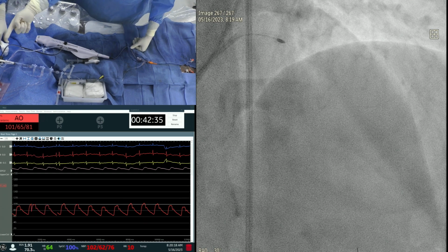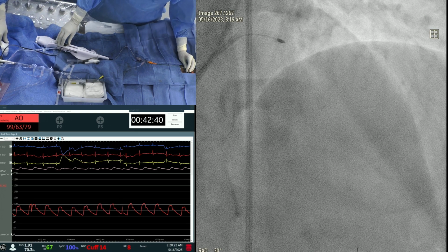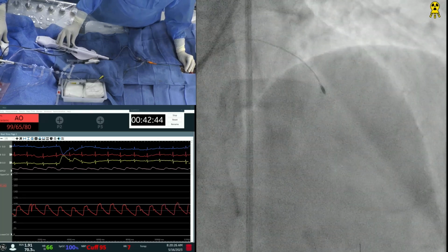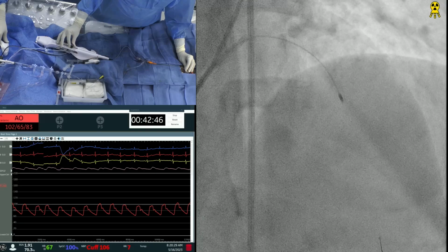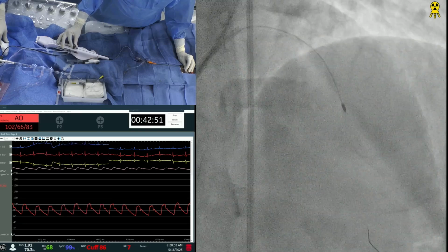So we can see it. So we are at 1 minute 30 seconds. But that's one lesion. Yes, one lesion. And now we are going to the second, which is further down. Yep. That will be much easier because that's a moderate calcium by my definition.